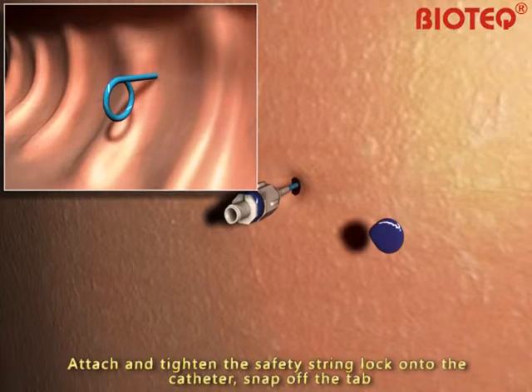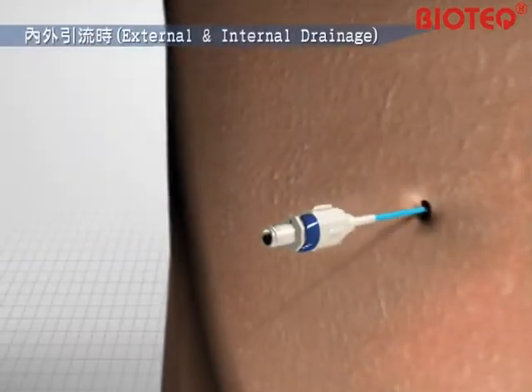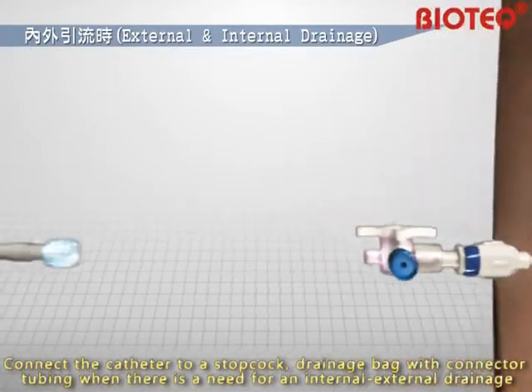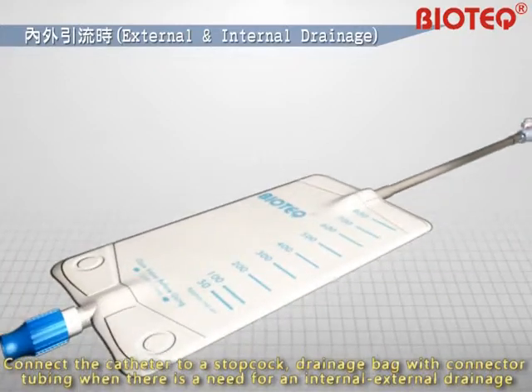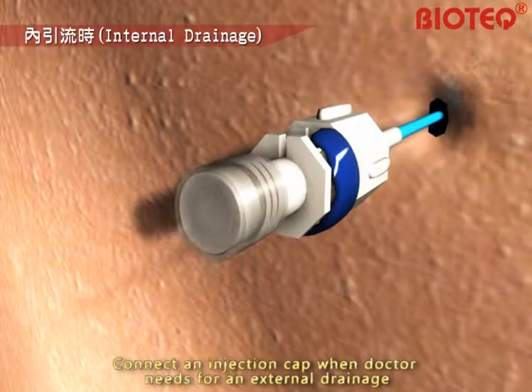Snap off the tab. Using fluoroscopy to ensure the correct position, connect the catheter to a stopcock drainage bag with connector tubing when there is a need for internal-external drainage. Connect an injection cap when the doctor needs external drainage only.